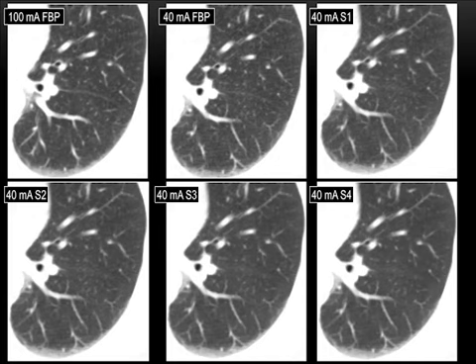As we saw earlier, it's very hard to find differences in the different images. These patients were scanned at 100 and then 40 mA, and probably you see a little bit of dark pixels over here in this lung parenchyma. And this is processed with different SAPHIR settings. And in terms of noise, it's very hard to find differences, but if you notice this lung fissure, it is completely gone at this setting.